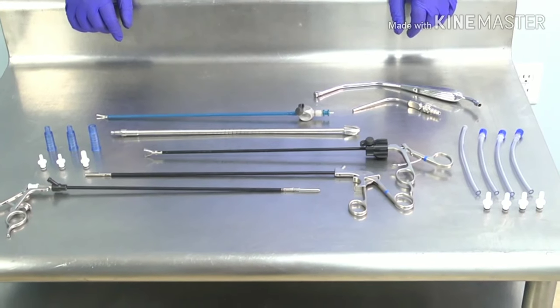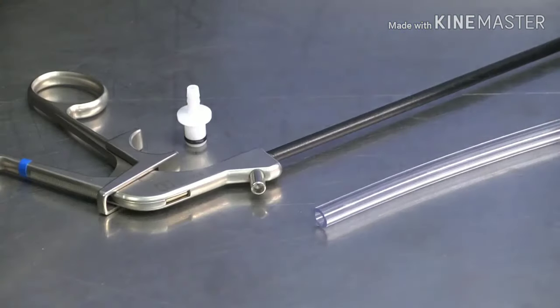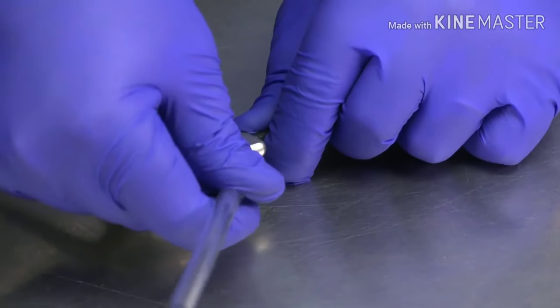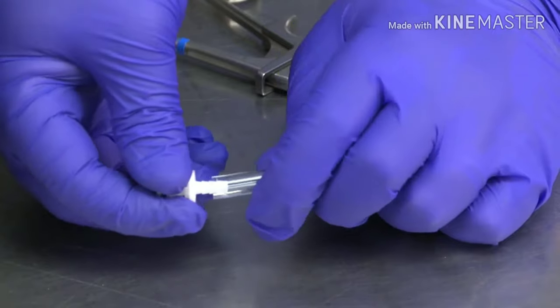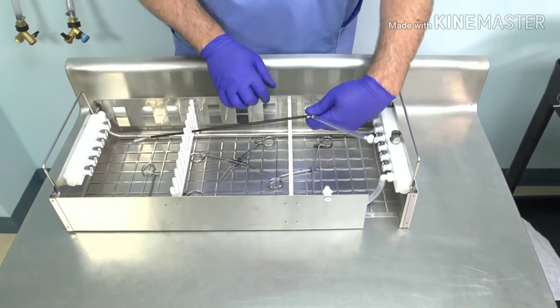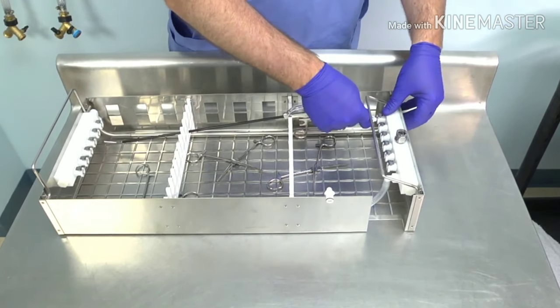There are specific ways to connect various lumen instruments to the flush ports in your basket. For laparoscopic instruments, connect a hose and a nozzle to the instrument port, open the tip fully and place into an empty slot in the organizer. Then simply connect the nozzle to the flush port on the basket manifold.